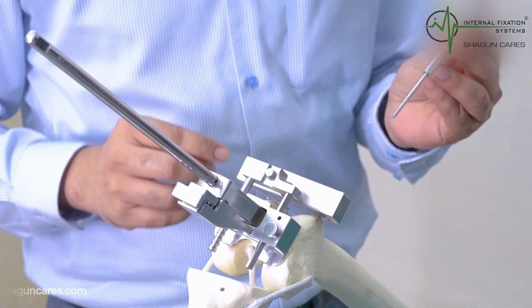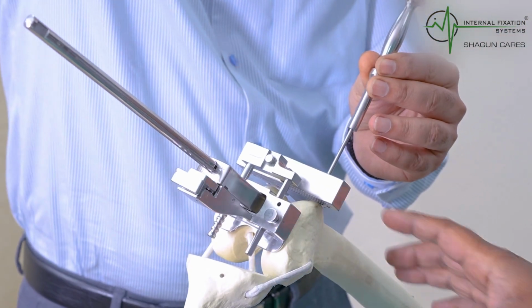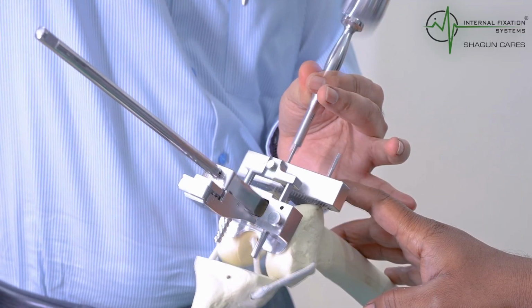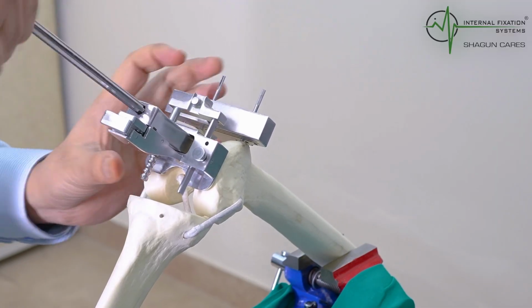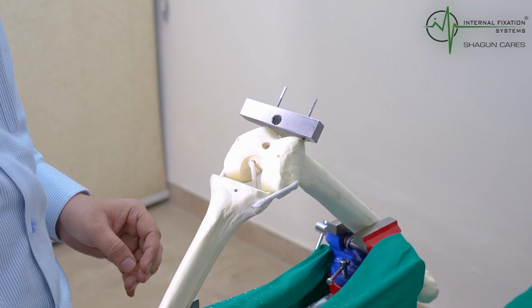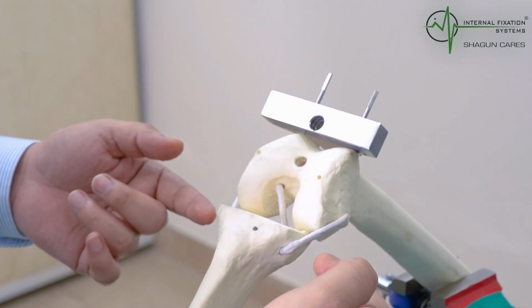We are going to now anchor the pins superiorly. We are going to take this out completely. Now this is ready for your cutting of the distal femur.